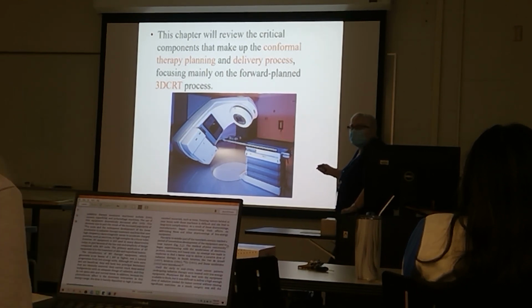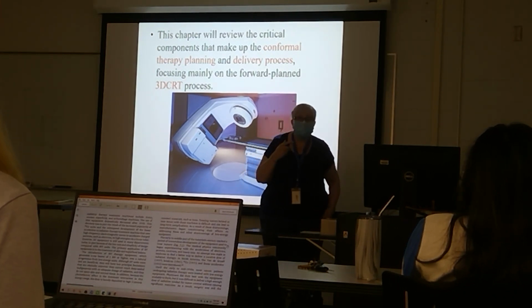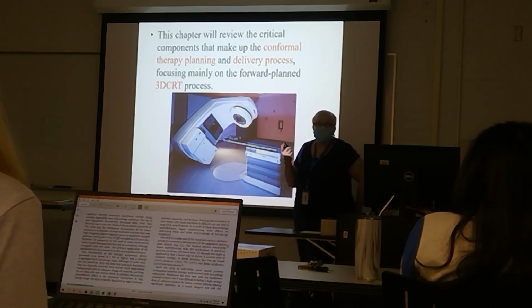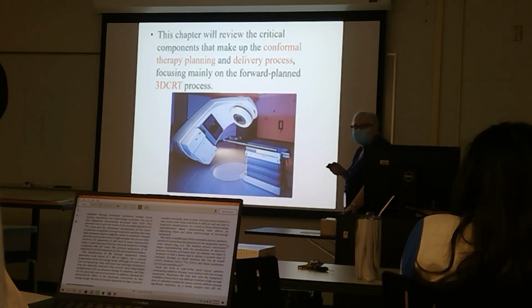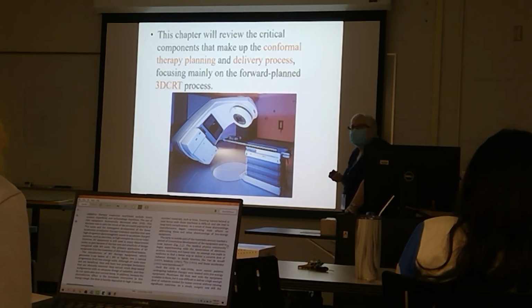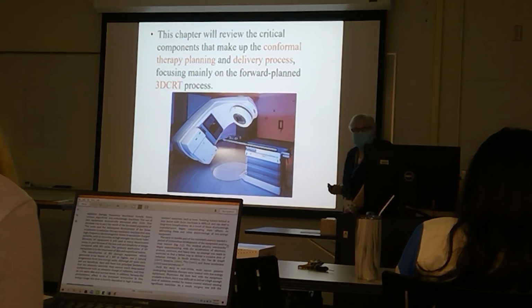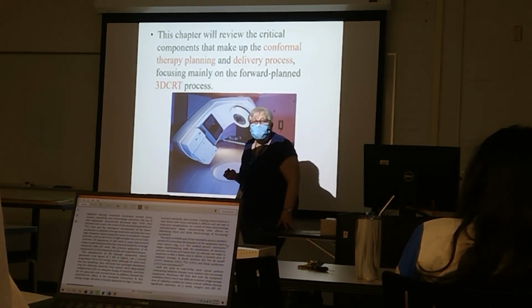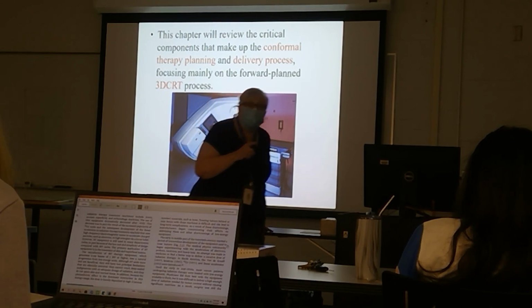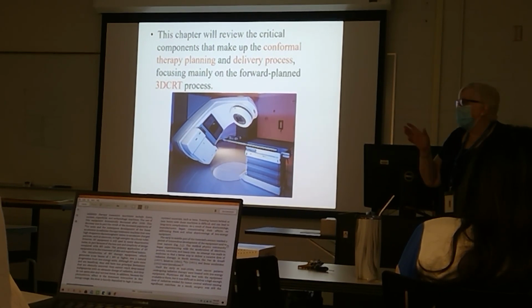The lasers are either red or green. Who has red, who has green lasers? Red? You got red? Green. Green? Okay. It doesn't matter which one you have. The green ones are more expensive than the red ones. Yeah, you guys are very bougie over there. But some people, in all seriousness, don't like green lasers because what happens if you're colorblind?